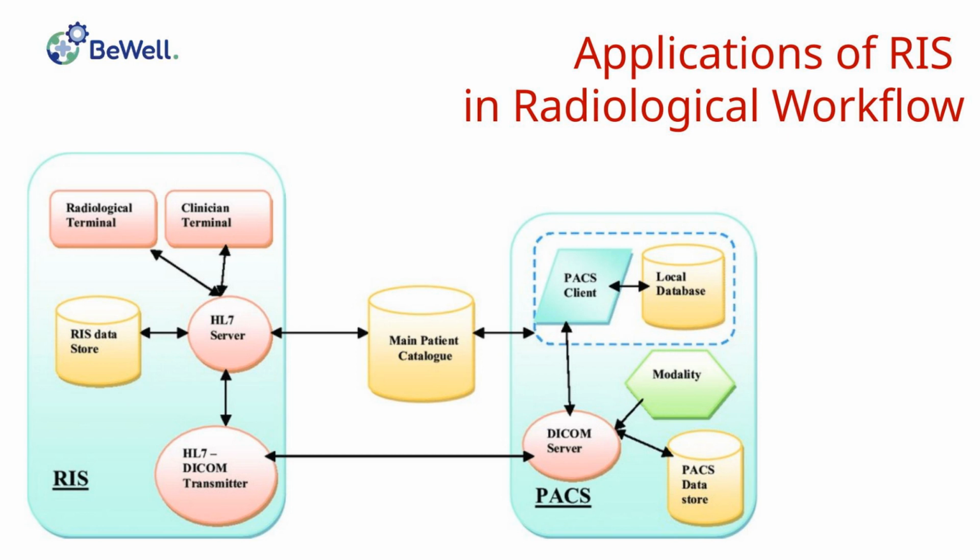Even in the more strictly clinical aspect, the IS can contribute to the compilation of the report by allowing the retrieval of pre-stored texts based on the type of pathology. In some cases, the entry of free texts can be directly performed by the IS through dedicated modules that enable voice input, that is, capable of interpreting the radiologist's speech and transforming it into a text file. At this point, the radiologist who conducted the diagnostic investigation reviews the entered text and validates it with a handwritten or digital signature, making it available for delivery.